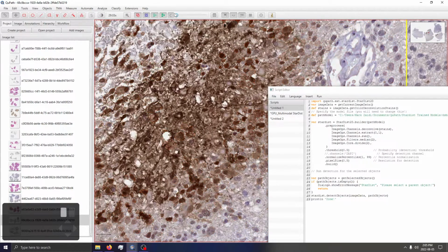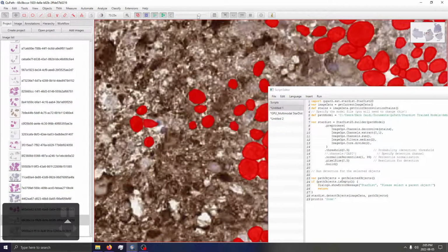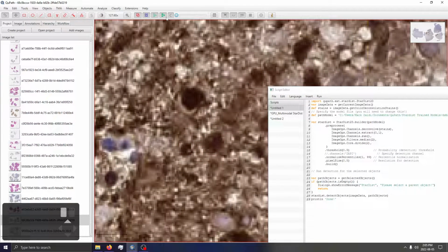Yeah, potentially. Actually, not potentially, almost amazingly. This is what I get for not trusting the research associate's code. You can actually see that it does a substantially better job in terms of detecting objects or cells, or nuclei in this case, that have a near maxed out optical density.